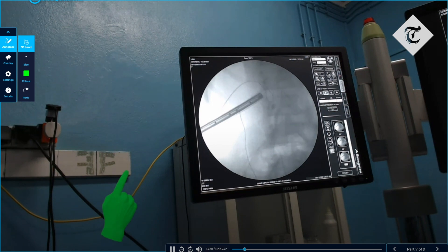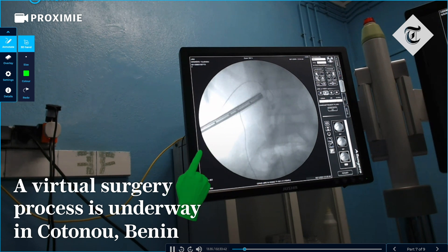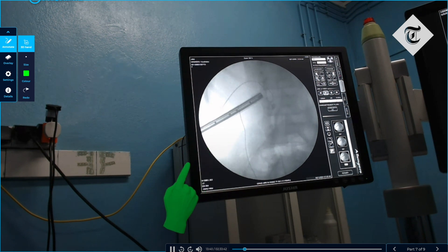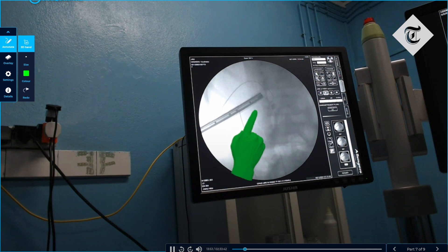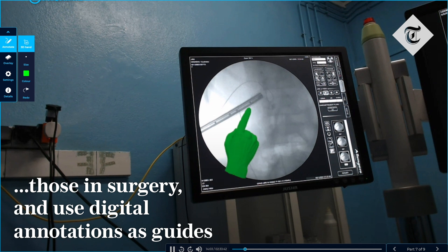Your contrast is going up to here. My concern is that we can't see this area — I don't know if that's because there's stone here. I think we've got some stone in this area here. The stone is sort of behind this; the sheath has gone a little bit past the stone, which is why we're not seeing it. Go back a little bit with your scope.